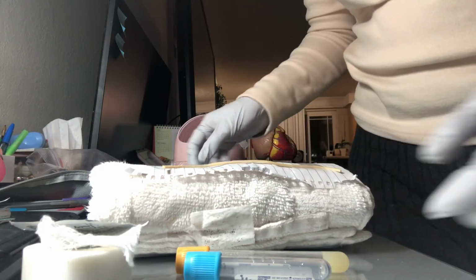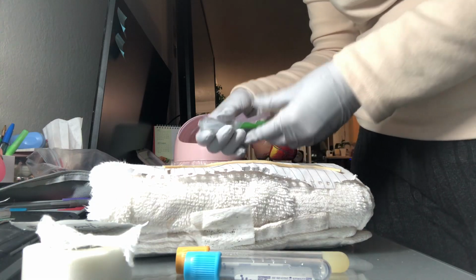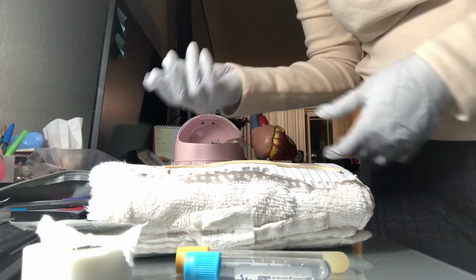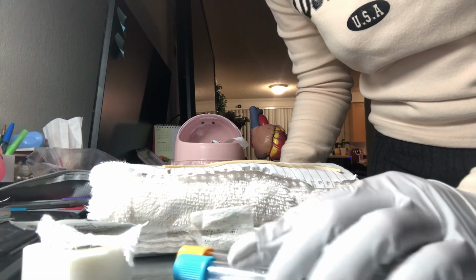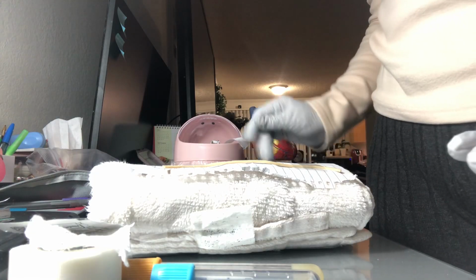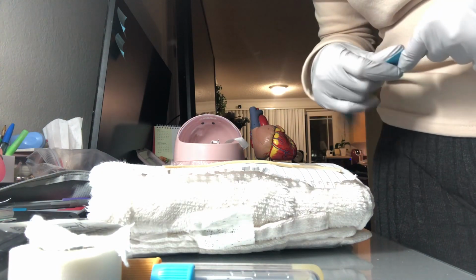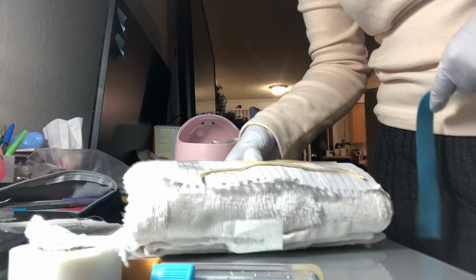So I'm going to set up my supply in the following manner. The needle is going to be on my dominant side, and anything besides the needle and needle holder is going to be on my non-dominant hand side. Okay, I'm going to perform vein selection on the patient's arm.